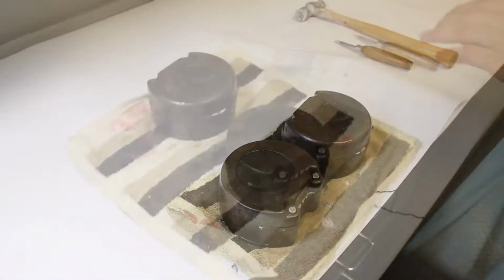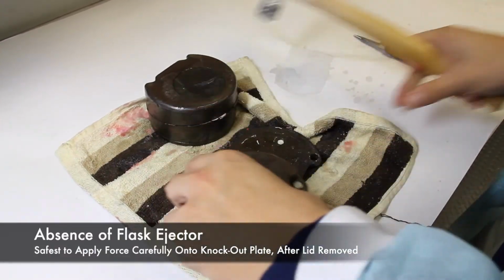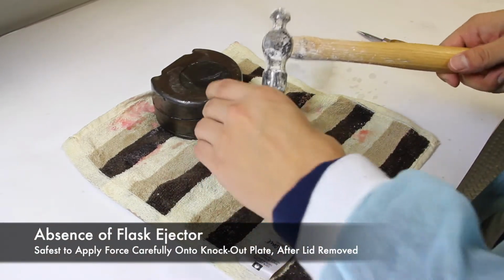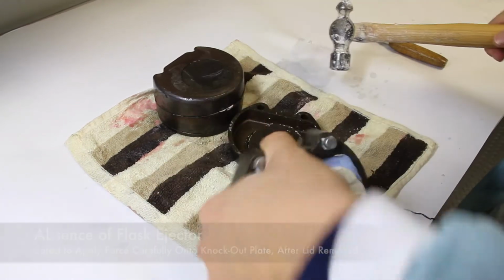As before, the first step is to remove the lid. Sometimes this can be done with a light tap to the flask. After, the safest is to apply force carefully onto the knockout plate. This is done in the absence of a flask ejector once again.